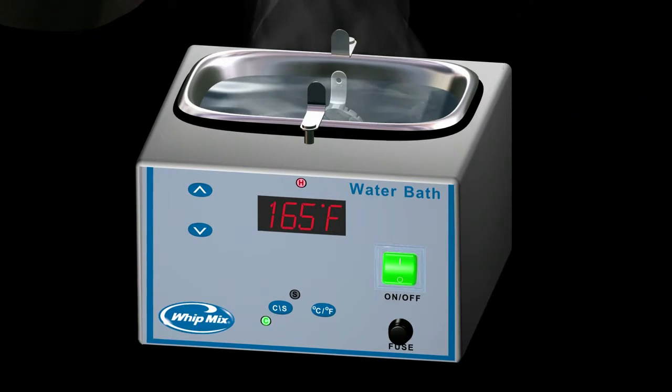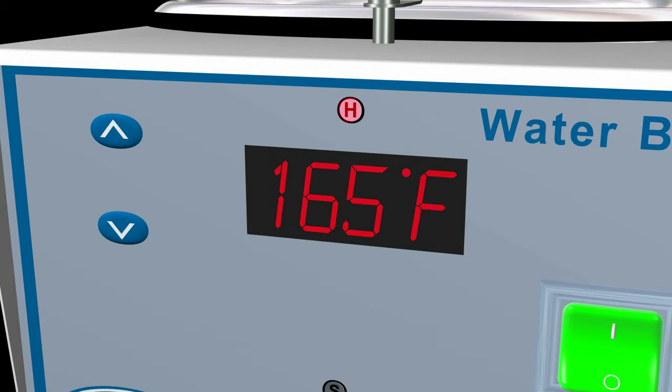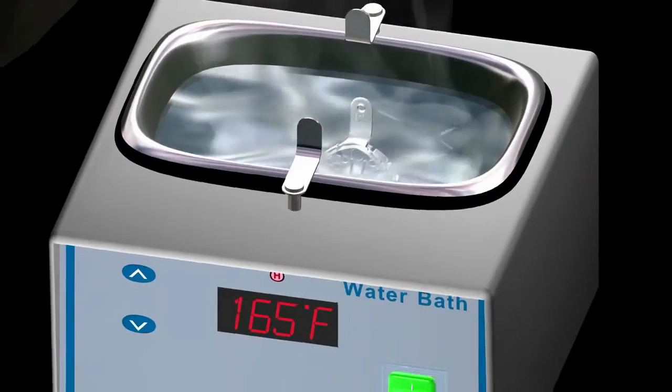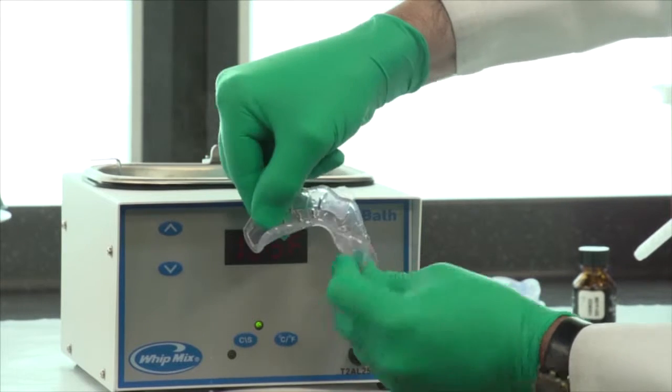It is important that the water temperature not exceed the recommended temperature, as burning or scalding of the patient or operator could result. The tray body should be immersed in the water bath at 165 degrees Fahrenheit, or 74 degrees Celsius, for approximately 30 seconds, or until the tray becomes rubbery.